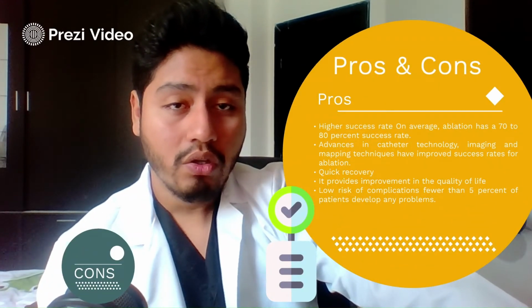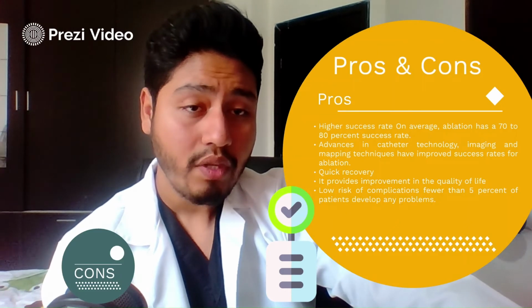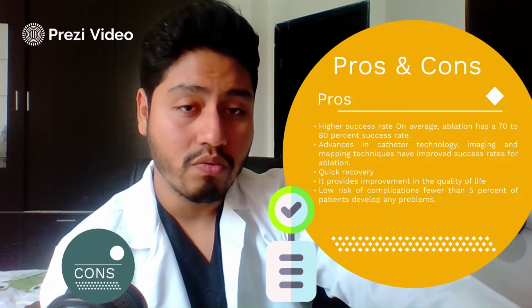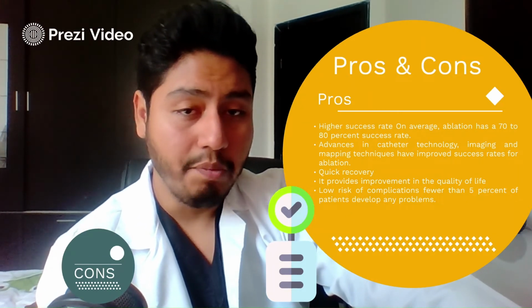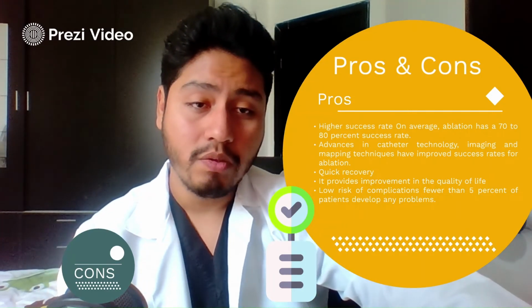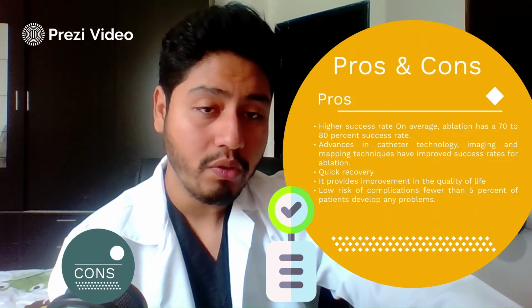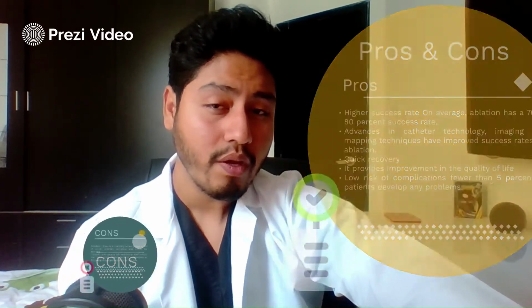The pros and the cons. The pros: high success rate. On average, ablation has a 70 to 80% success rate. Advances in catheter technology, imaging and mapping techniques have improved the success rate for ablation. There is quick recovery, and it provides improvement in the quality of life. Low risk of complication: fewer than 5% of the patients develop any problem.